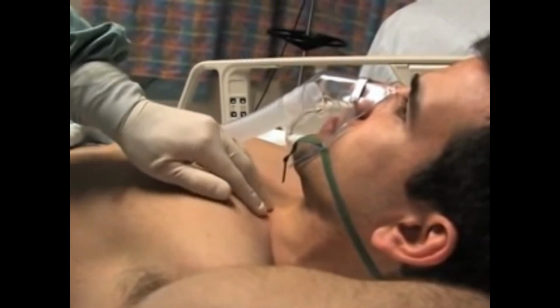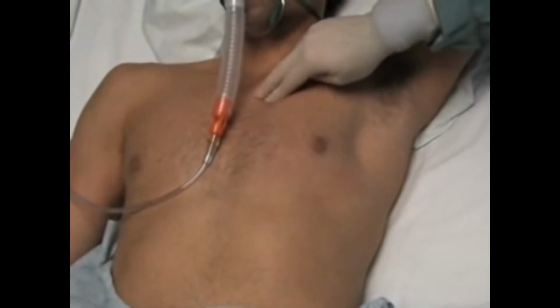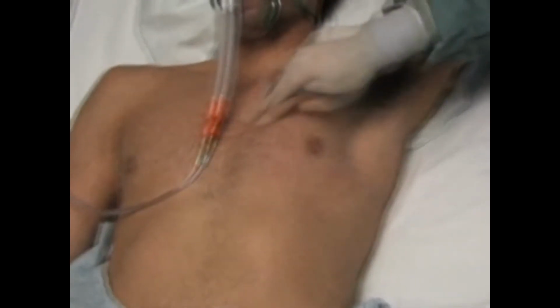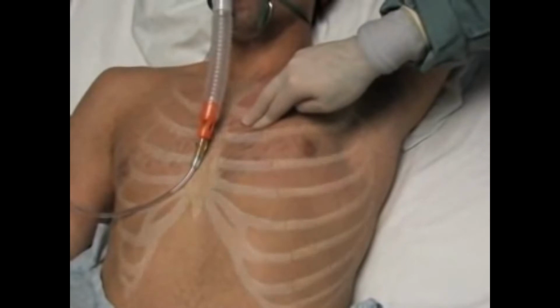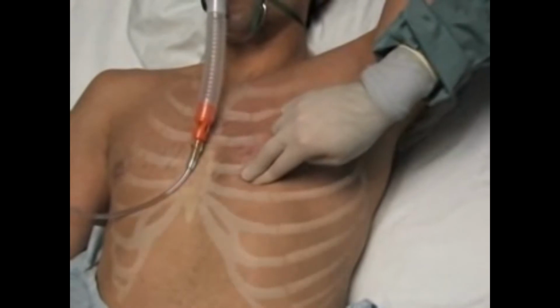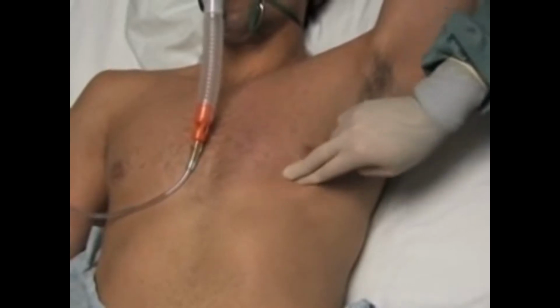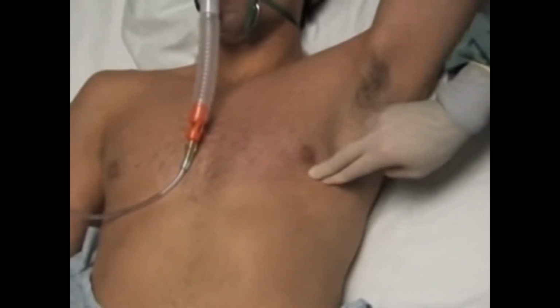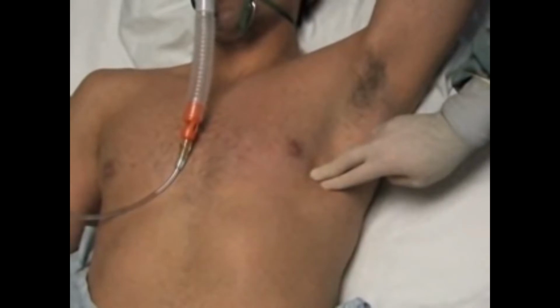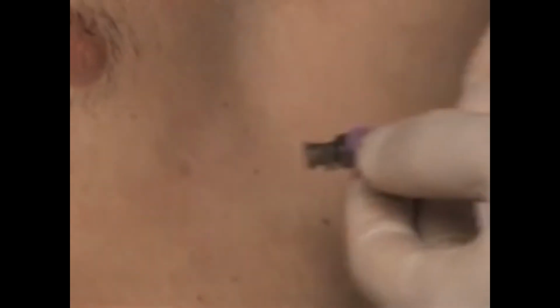Start landmarking by localizing the clavicle, and next count rib numbers as you go down the anterior chest wall. Once the correct intercostal space is found, move your hand laterally towards the anterior axillary line. The incision will be made here. The chest tube will be inserted 1 interspace above this point. Mark the incision spot with a marker or needle cap.